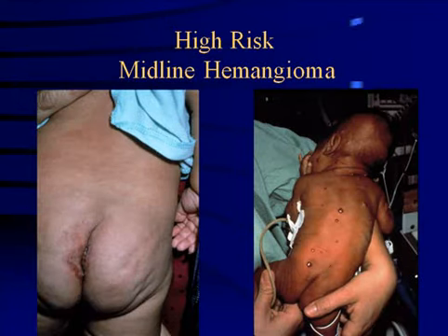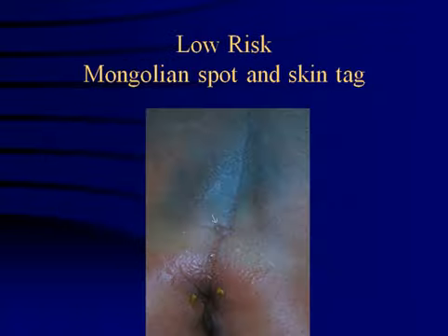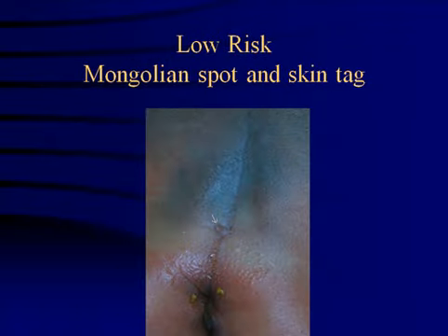Here are examples of high risk midline lesions. And this is a low risk lesion with a Mongolian spot and skin tag.